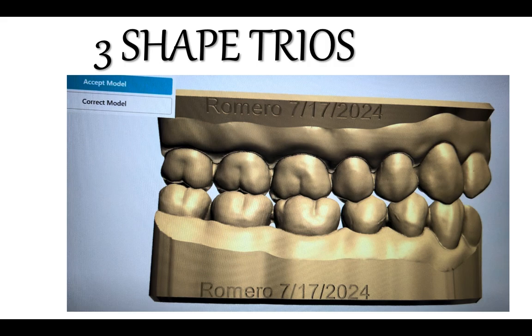This 3Shape Trios is for the whole thing. It is for scanning the prep, for milling, for designing, and it can also be used to do other things. For example, remember this model that I created for you to have a full 3D diagnostic model that you can study for doing the number 30 MOL prep.